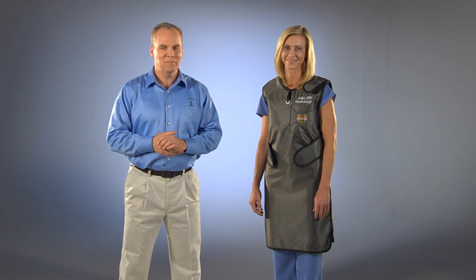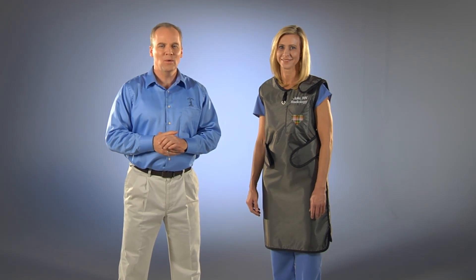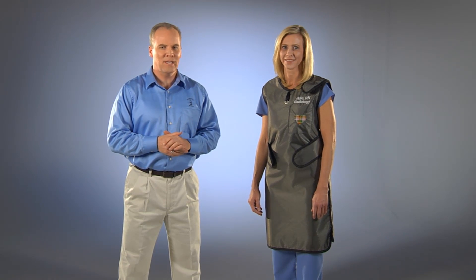Hi, this is Bill and Julie from Burlington Medical. In this video, we are going to go over the Euro One Front-Back X-Ray Apron.